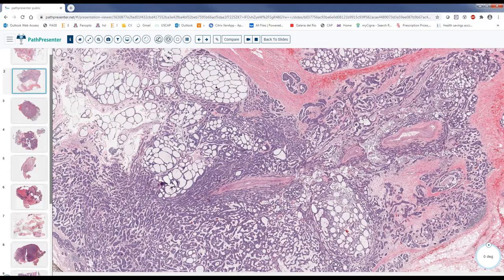But we have small fragments of tissue, we really want to reserve it. So again, if you have a c-KIT negative tumor, it is unlikely to be adenoid cystic carcinoma. Okay. What is the next step you can do? What is the immunostain? Actually, there is an immunostain. I saw it being described, but you can order it as immunostain or FISH, which is excellent.